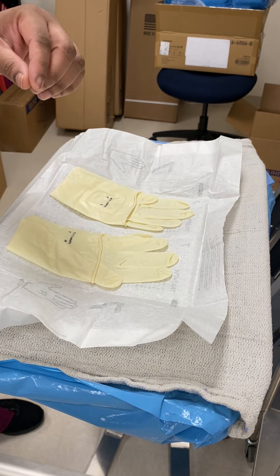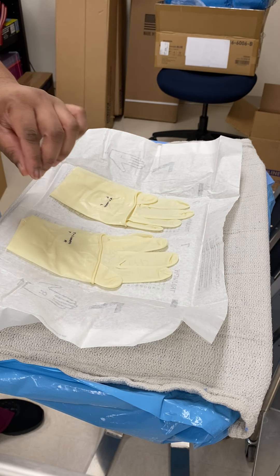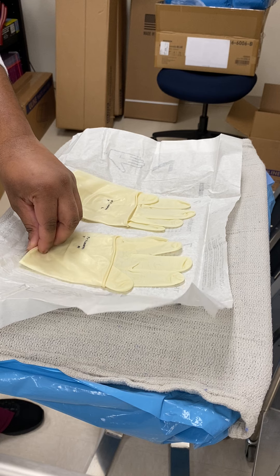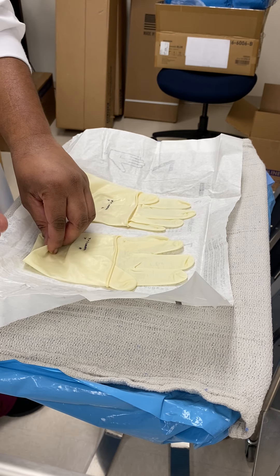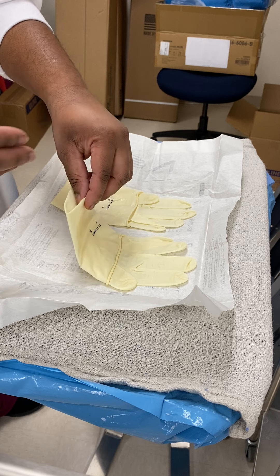The first thing that you're going to do is pick up the cuff of the right glove with your left hand — so I'm picking up just the cuff. Then slide your right hand into the glove until it feels snug and it's over the thumb.